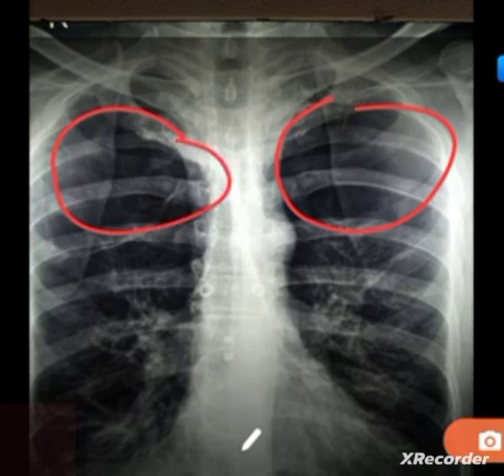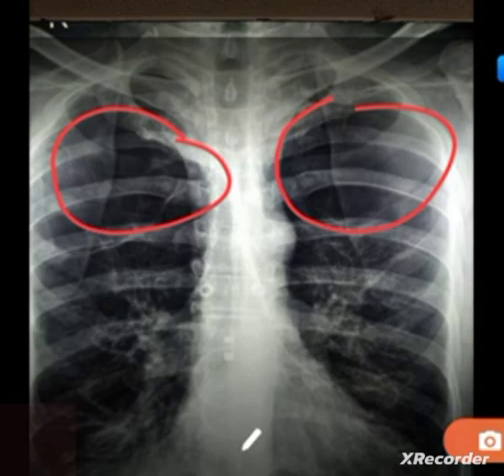The differential diagnosis to consider is TB — in someone who has had TB, you may see bilateral upper zone emphysema or upper zone cavitation. However, since cavitation is not visible here, this is predominantly emphysematous change rather than TB-related pathology.